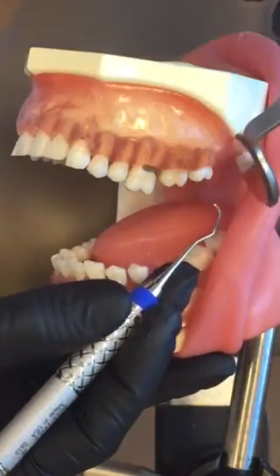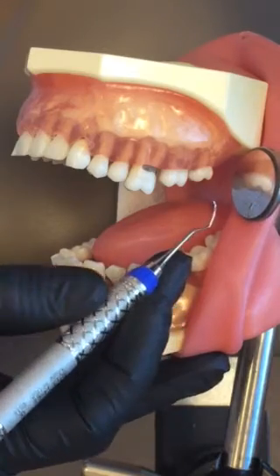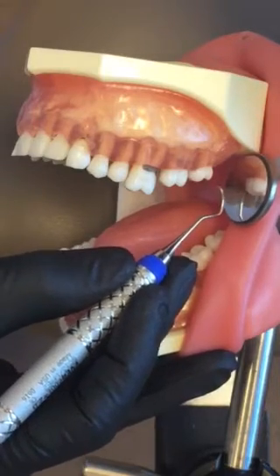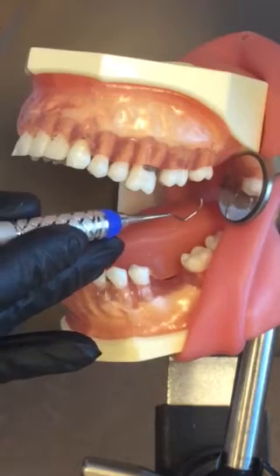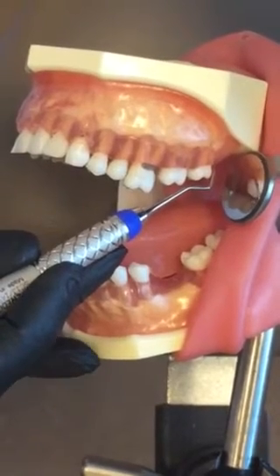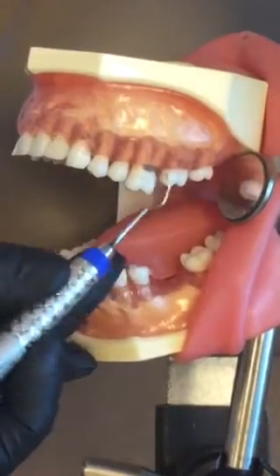I would be retracting with my mirror so I can see the distal of the most posterior erupted tooth. Patient is turned towards me. I prefer an extra-oral chin-cup fulcrum for this quadrant, or you can also fulcrum internally or intraorally on the mandibular teeth. Slide your hand back onto the handle in order to get enough reach to reach the distal part of the most erupted tooth.